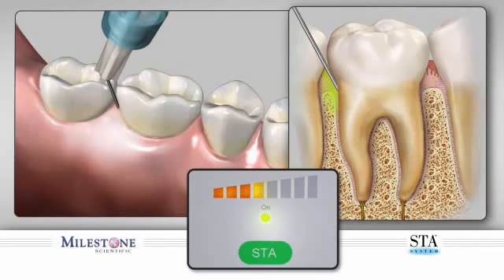Advance the needle forward slowly into the sulcus. Move the needle gently down into the sulcus until you reach resistance. Maintain approximately a 45-degree angle while holding the needle in place with moderate hand pressure. Do not use excessive hand force on the needle, as this may block the flow of solution into the tissues. Carefully control and stabilize needle movements using a finger rest.